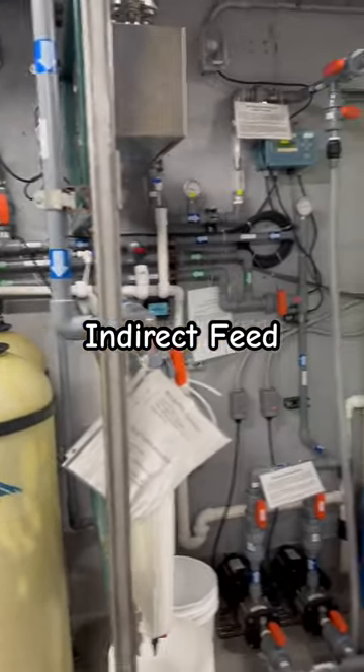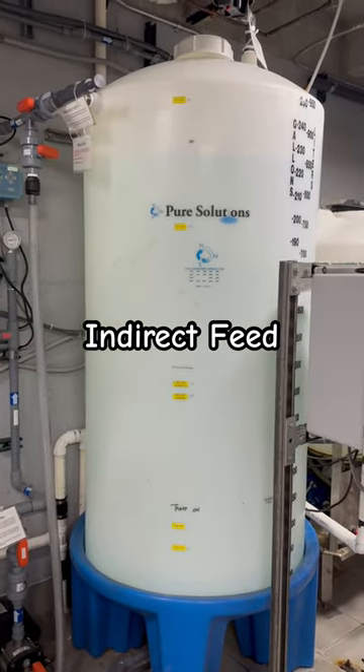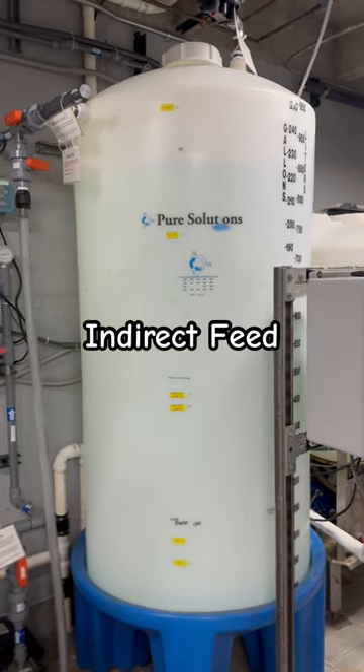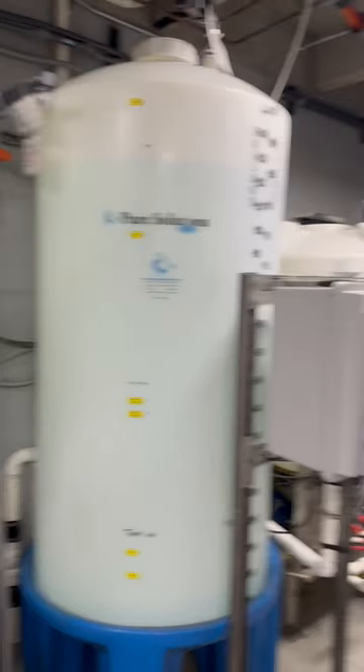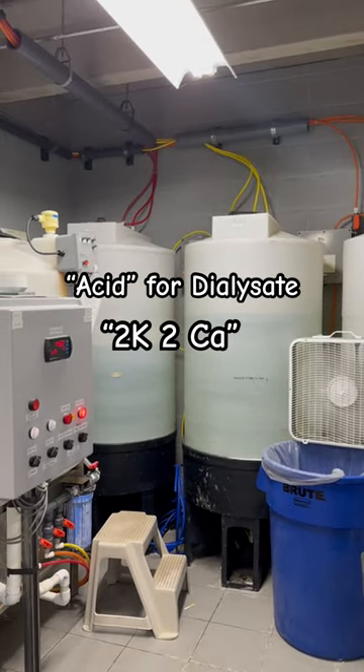Next, our water system has a holding tank, so we have an indirect feed. The RO turns on and off based on the water level, and when we need the water for our patients it gets pushed up to our dialysis machines. This is another holding tank, but it's for our acid that we mix for our patients.